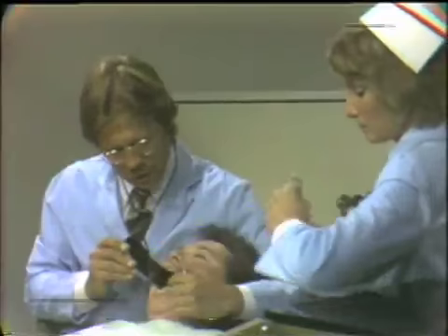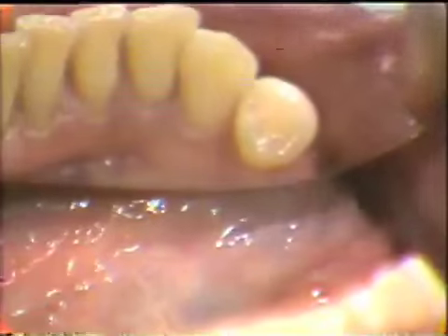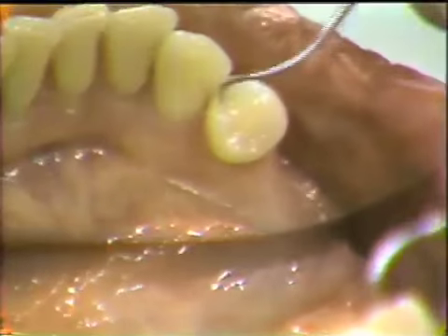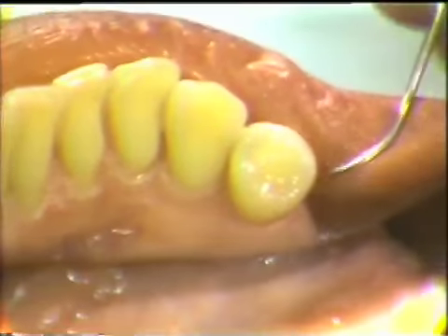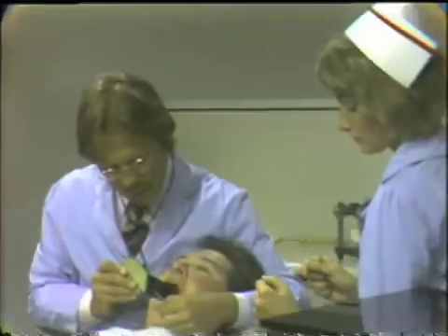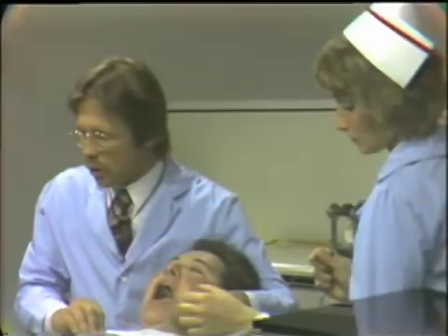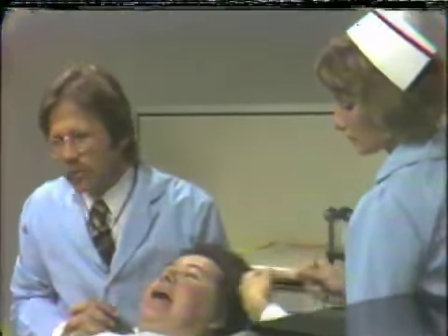Now we're going to look at the condition of the tooth on the opposite side of the arch, the other abutment tooth, and we see that that tooth is non-restored and is in good condition. It has no restorations and no existing decay. Now, going on, I'm not going to go all over the arch and show the existing restorations, but this should be done on every patient and should be recorded because it's going to affect your treatment plan.